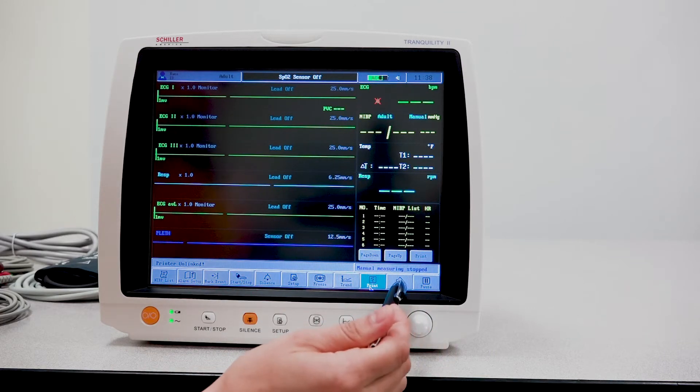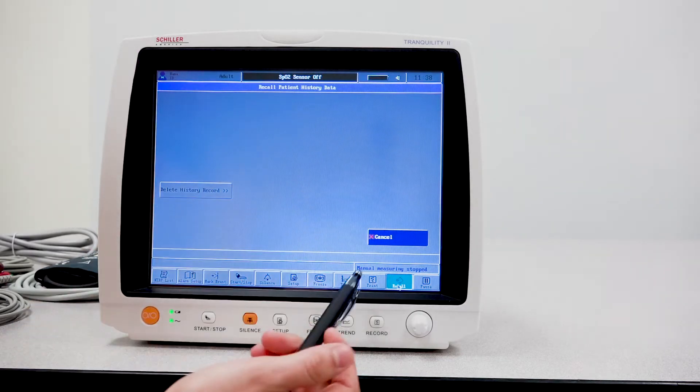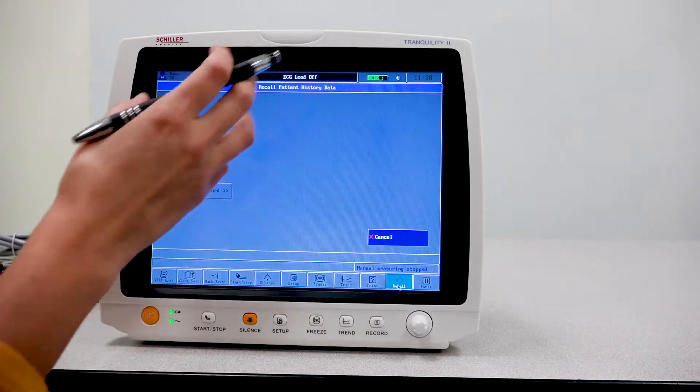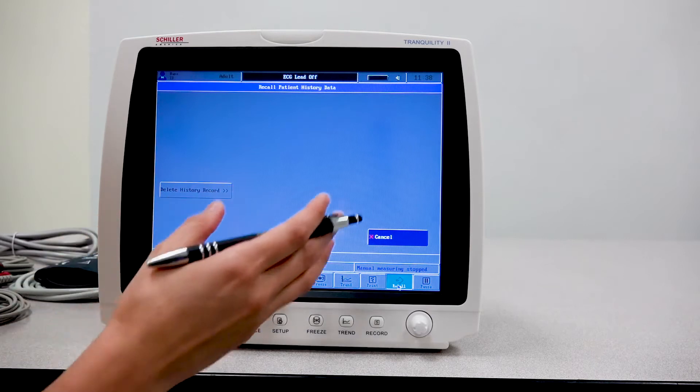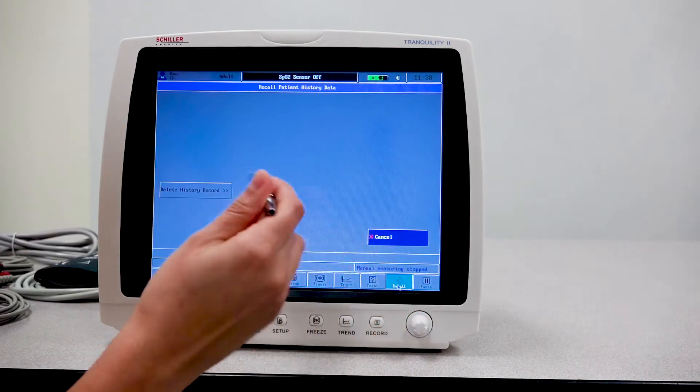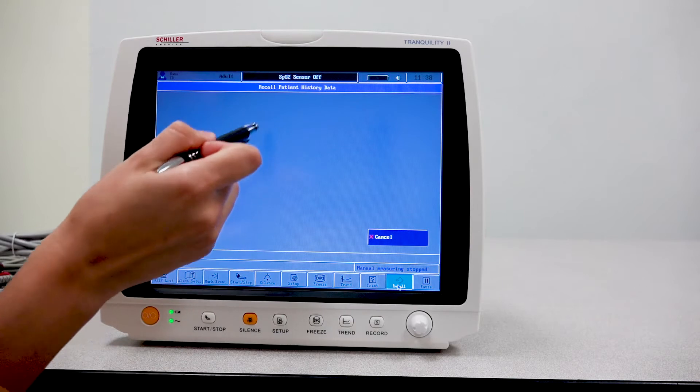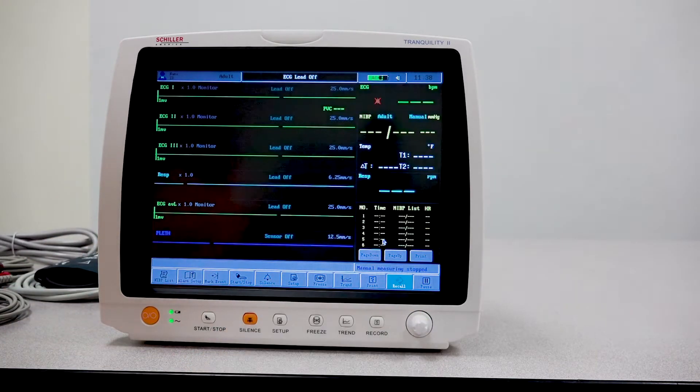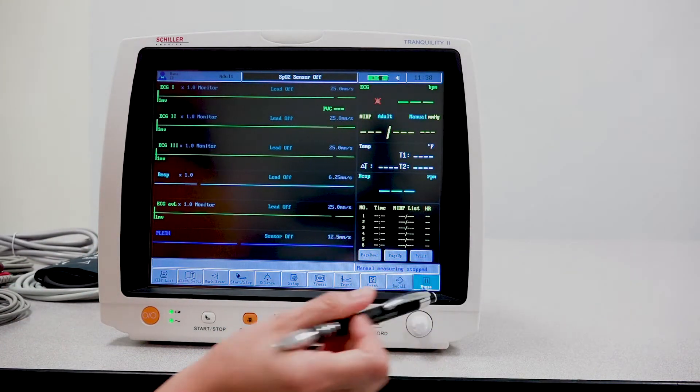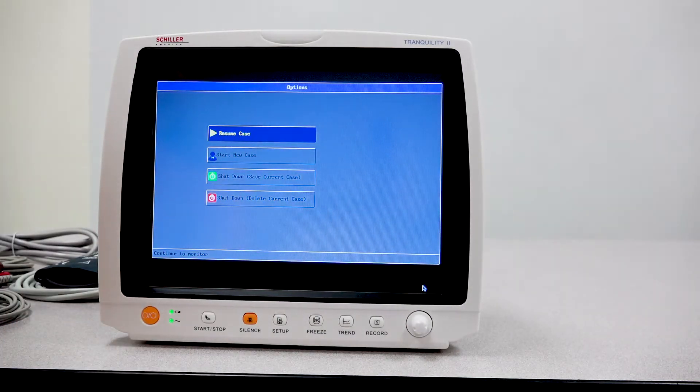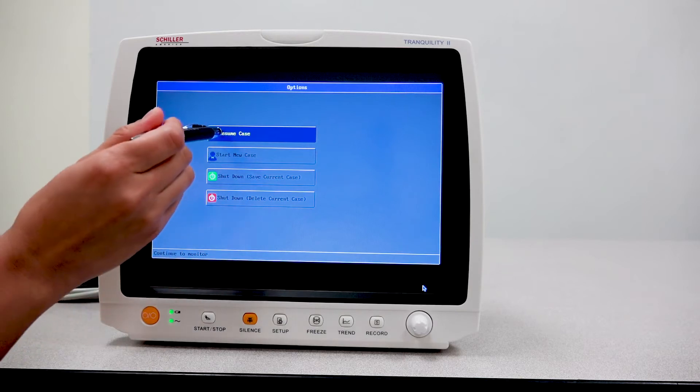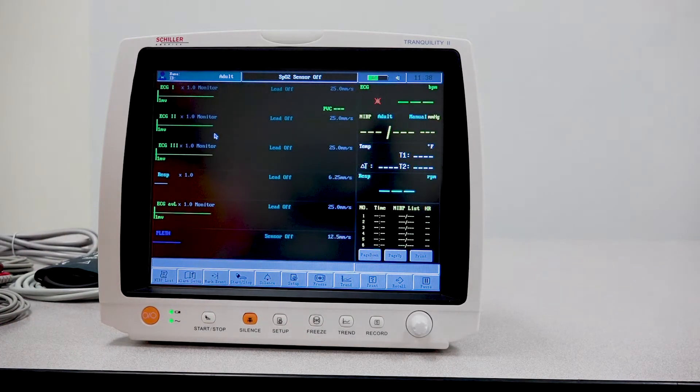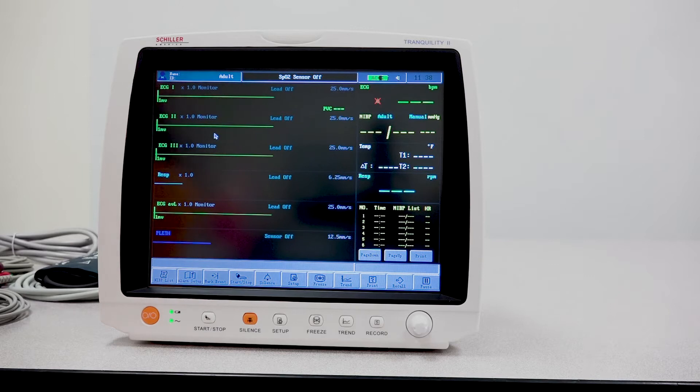Your next option is a recall option. This allows you to recall patient measurements or patient data from prior moments or prior times. You'll just select and it will be displayed here. And then pause will just pause everything. Once the doctor or nurse is ready to resume again, they'll press resume case and back to the main screen we go.